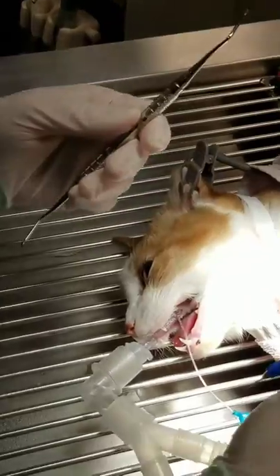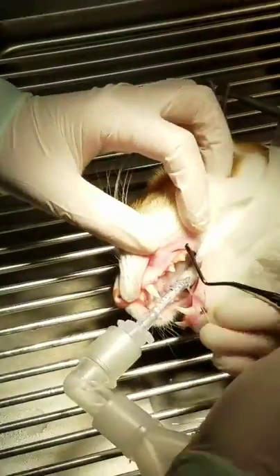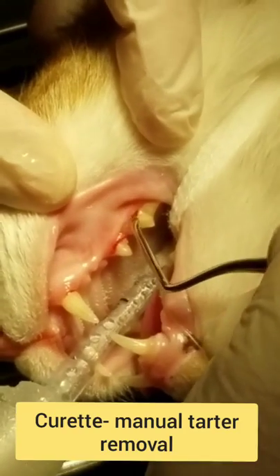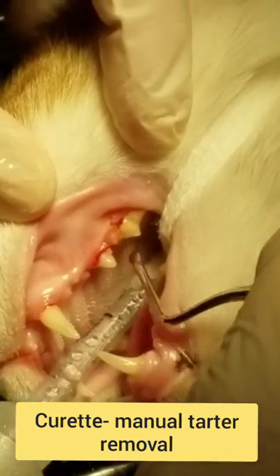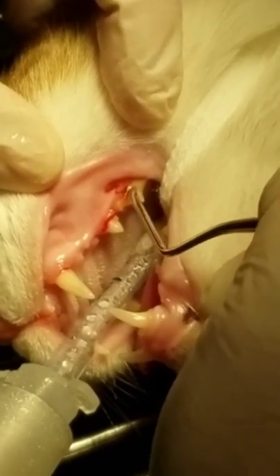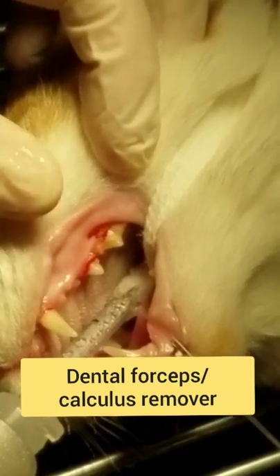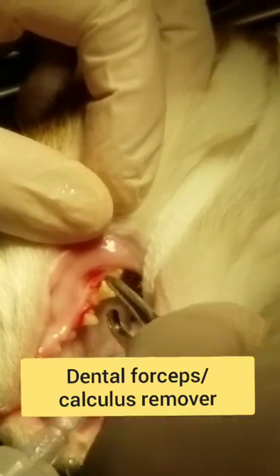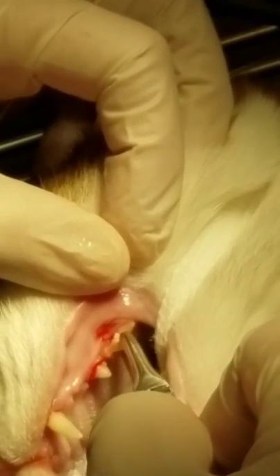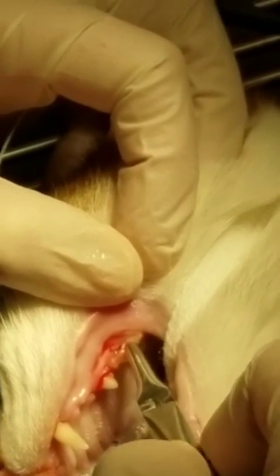Okay, friends start. So, using the manual to get some tartar off. We can also use this to get some tartar off. I've never used one that's balanced correctly. Like that on the floor. Maybe a better shot with the dog with that one.